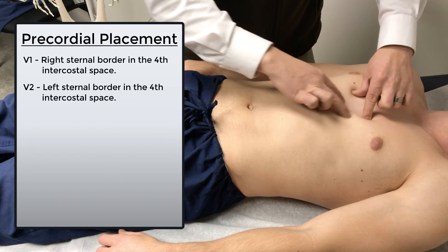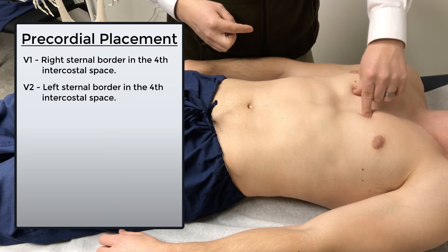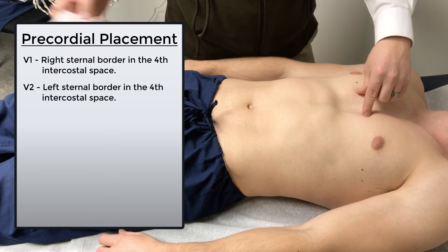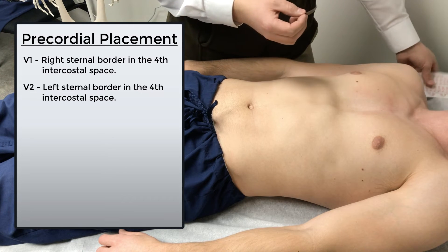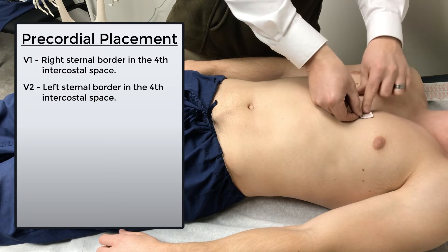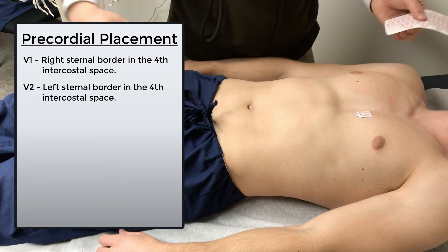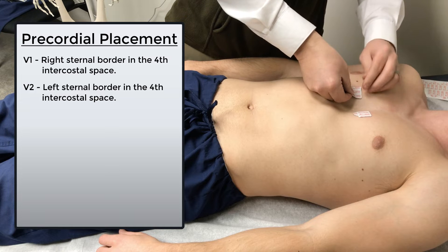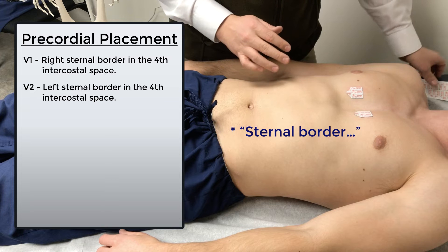Right along the sternum on the left and right sternal border in the fourth intercostal space is where we want to place our V1 and V2 electrodes. I like to have the tab that our lead is going to clip onto facing down, because that tends to make it easier to grab onto when I have my wires coming in from below. So V1 and V2 go in the fourth intercostal space along the right and left sternal border.